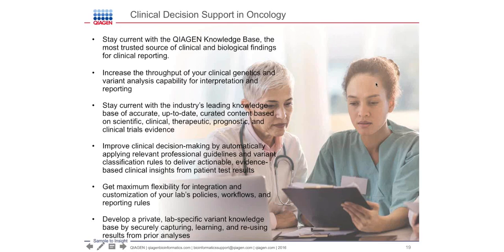FGFR1, for example, has nine different transcripts, and you can see all these nine different transcripts in the variant detail page. And if you are interested in some other transcript other than the default transcript, you can toggle between the nine transcripts and select the one you wish to analyze. So all the information is pertinent to the transcript you have selected.